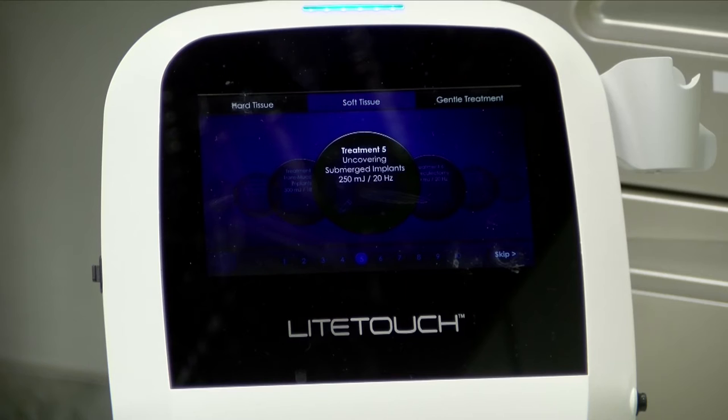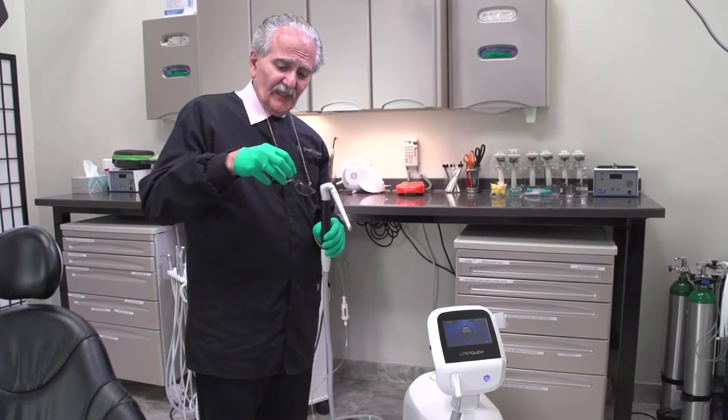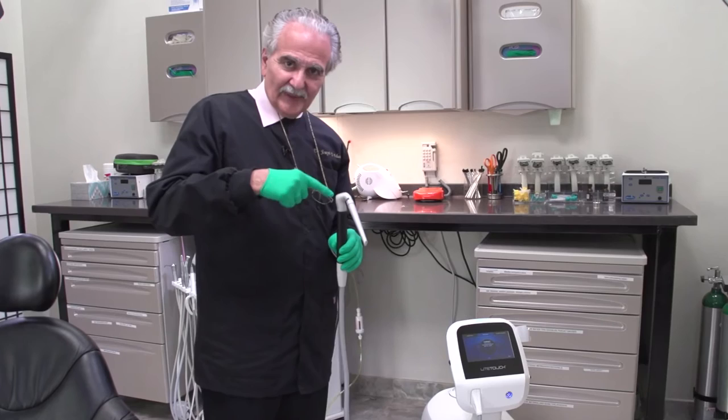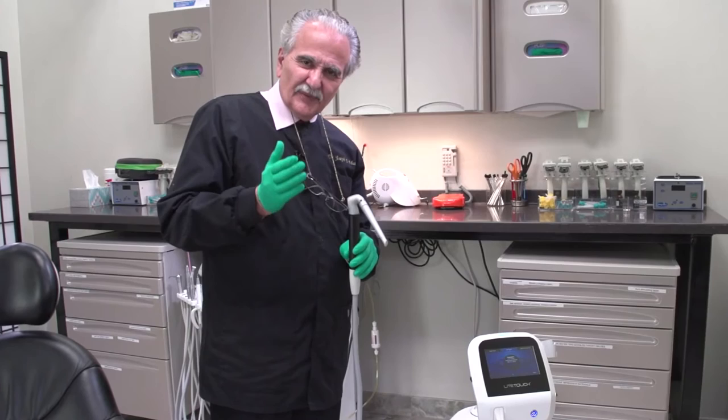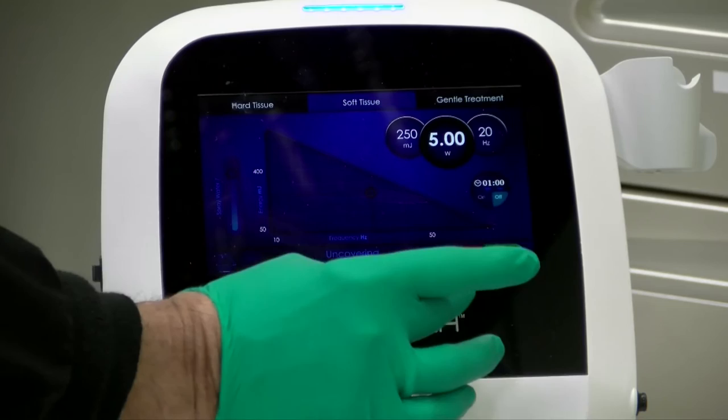I'm going to open up and uncover an implant. You could also use this for retracting around the implant, especially once you've taken off the healing abutment — many times the tissue will just kind of collapse. I want to open that up and put in an abutment, and if the height of the sulcus is too large, you can actually reduce it.